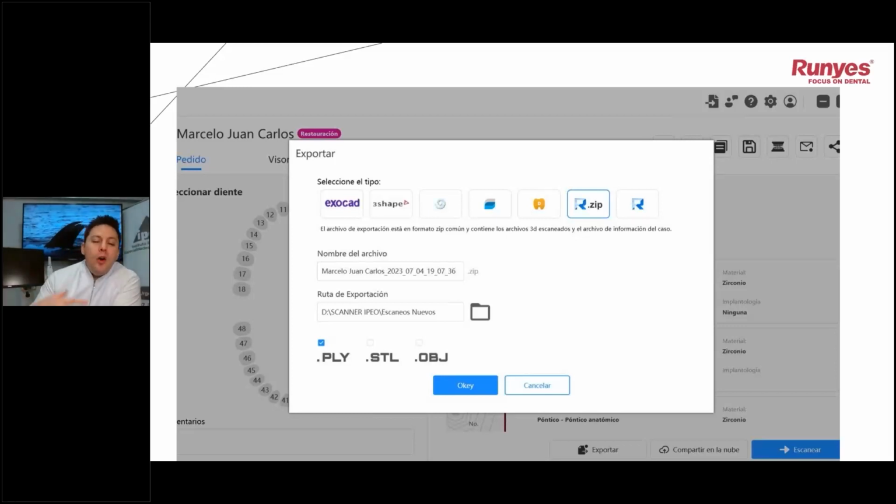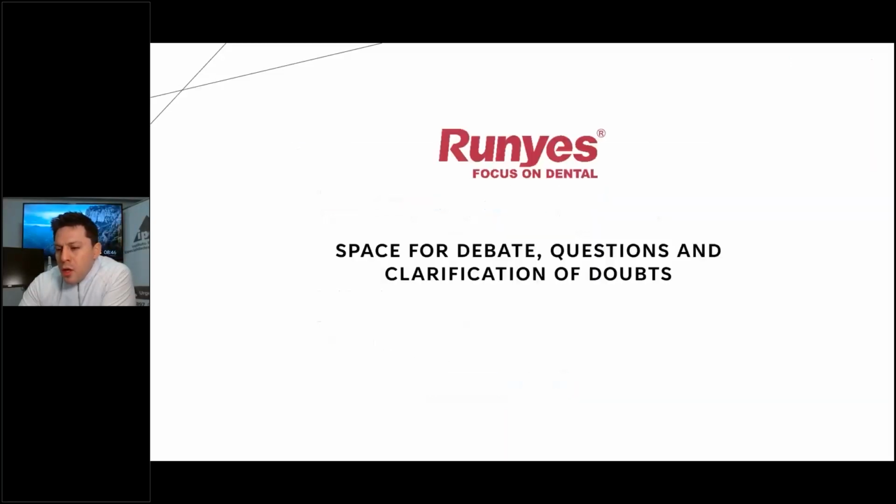PLY, STL, OBJ, 2 of them, 3 of them. We can export in all 3 types of files if we want, because this software gives us that option. So let's continue a little bit with the questions that we have on our scanner and our software.